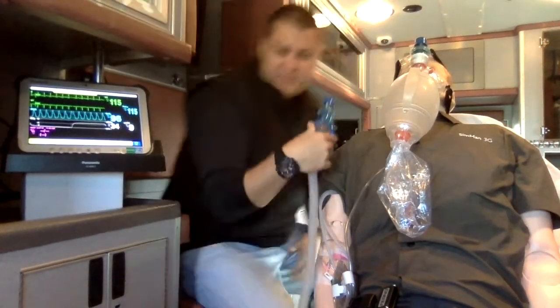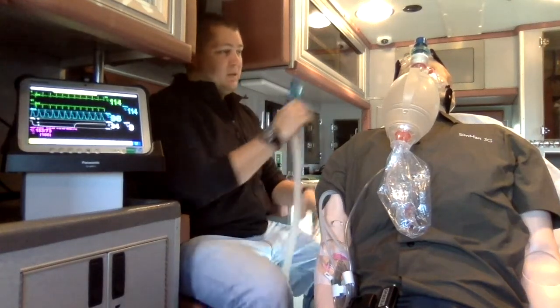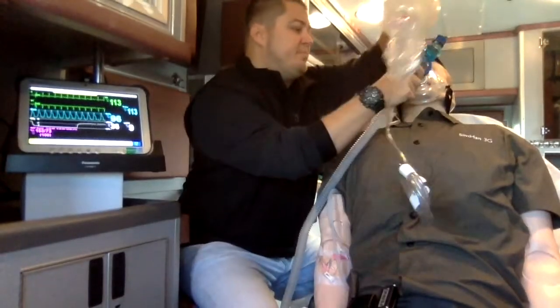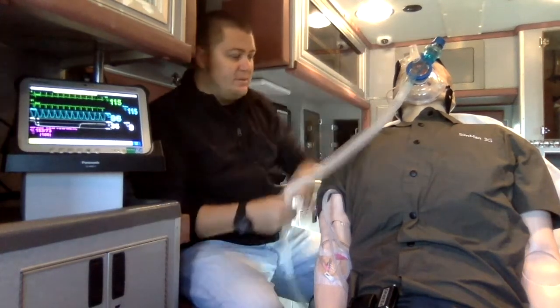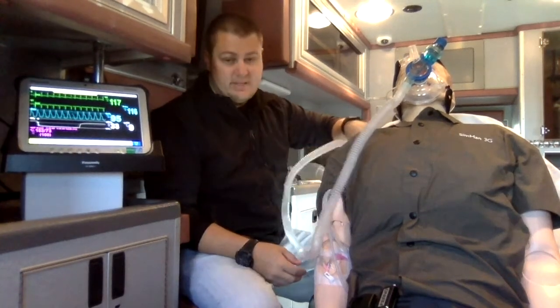I grab our simple vent circuit. I apply PEEP of 7.5 again. On inspiration, he gets a full breath. I'm going to discontinue the BVM and place my ventilator in place of the BVM. Still have PEEP. Now I have a guaranteed tidal volume and a respiratory rate, so I can guarantee minute volumes.